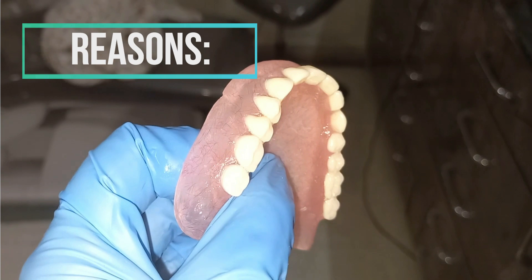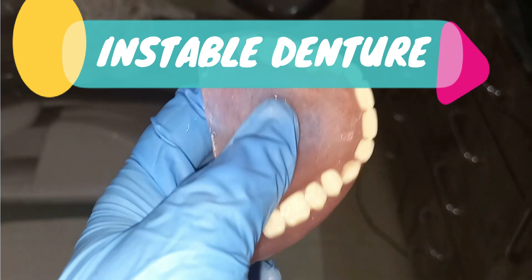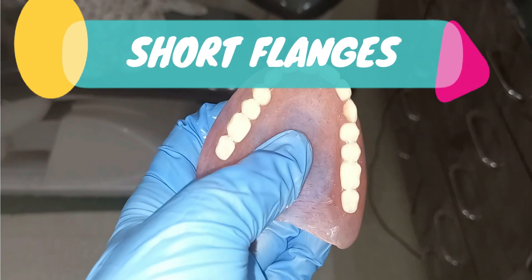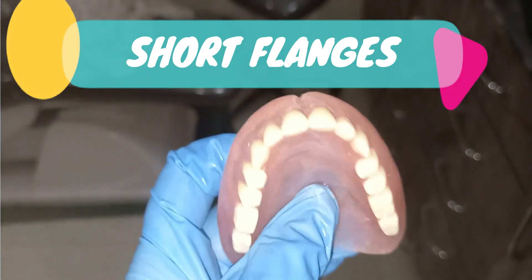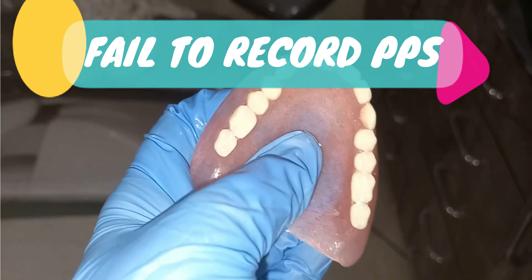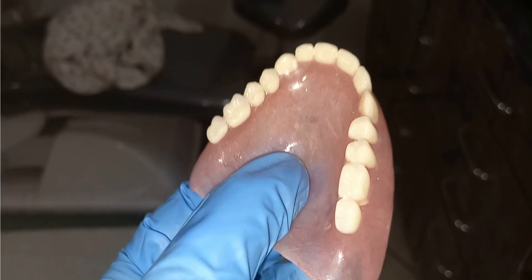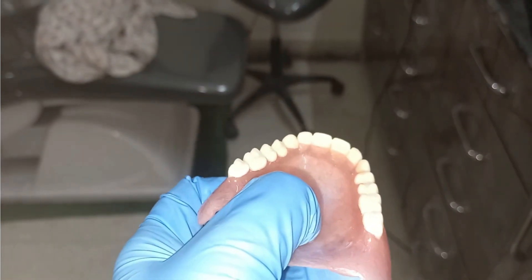Reasons for lack of retention include: first, lack of stability — if the denture is unstable, it will never be retentive. Second, if the flanges are short or frena are not relieved. Third, if the PPS is not correctly recorded and there is a lack of seal. By correcting all these points, you can correct the retention and make the denture retentive.